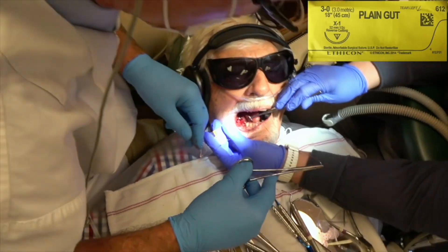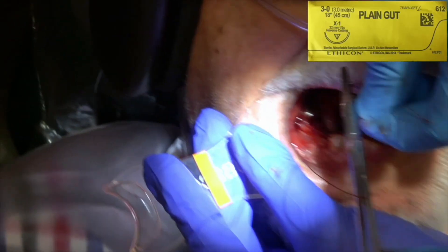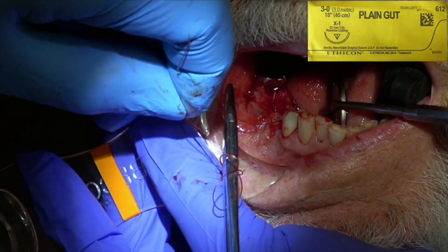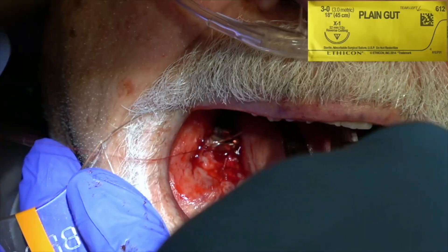When you suture, you want to go one, two, three away from you — pull — one towards you — pull — one away — pull, pull. If you go one, two, three it stops; the knot stays put. If you only go one, two, sometimes the knot won't stay put. Taking out brittle decayed teeth, especially on elderly people, is one of the most unpredictable procedures you can perform.